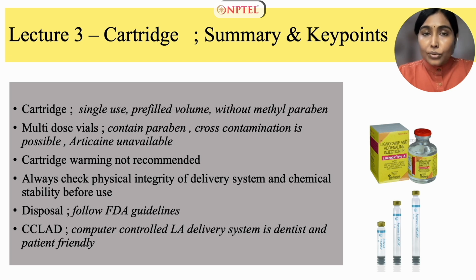Consider computer-controlled local anesthetic delivery system for the benefit of dentists as well as patients.